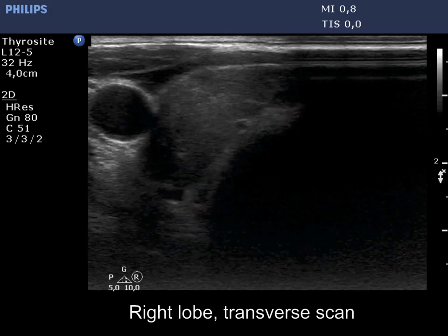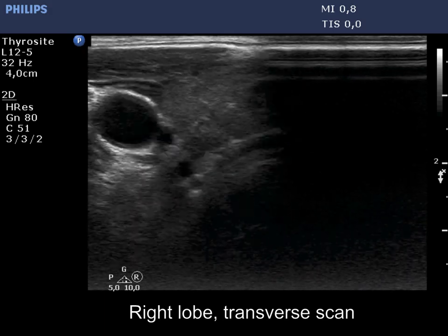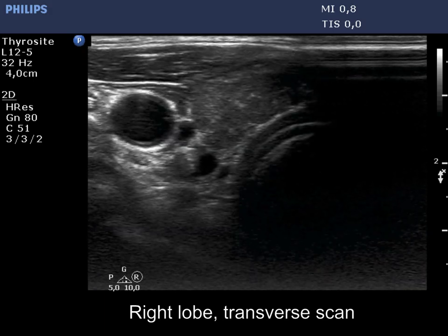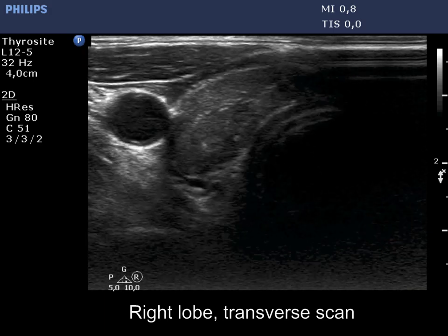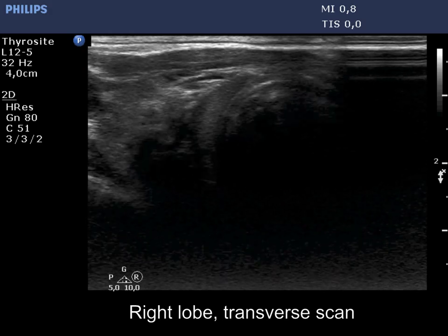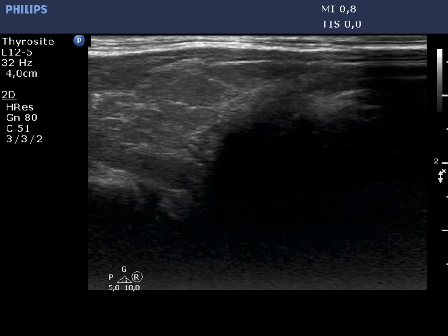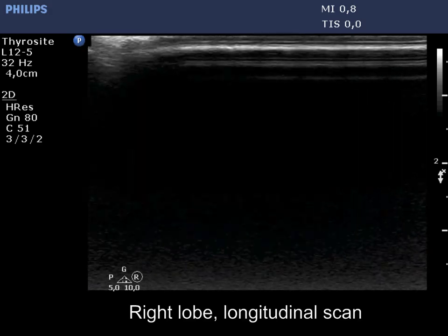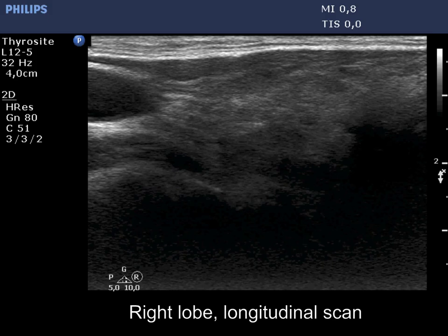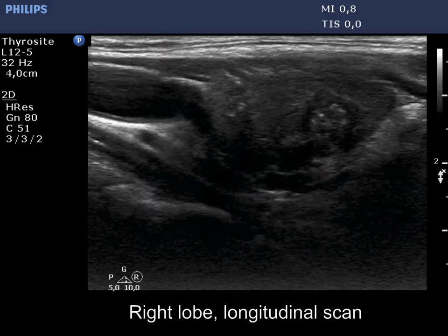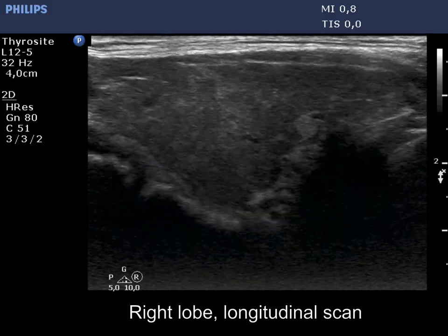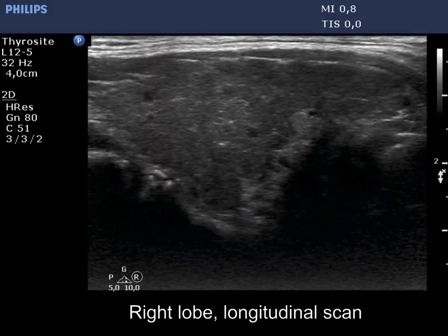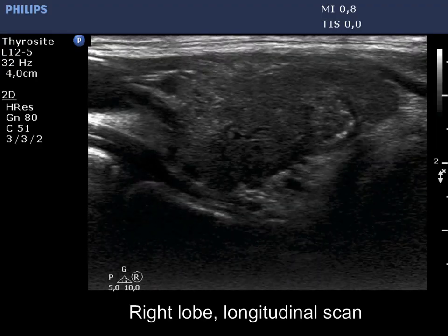Corresponding to the underlying Hashimoto's thyroiditis, the thyroid is hypoechoic. There is a more hypoechoic nodule in the dorsal part of the lobe. The lesion has bright echogenic foci. These are obvious presentations of microcalcifications.